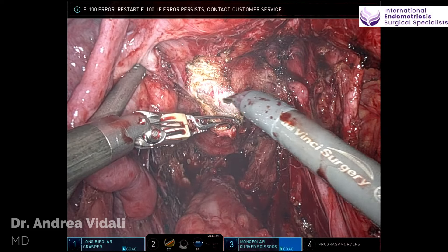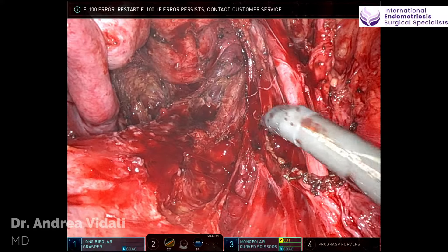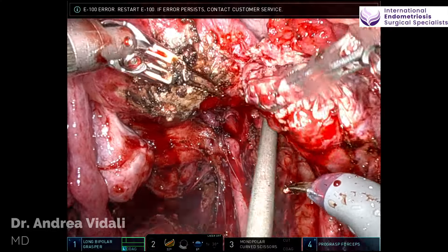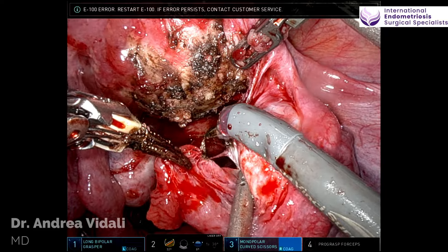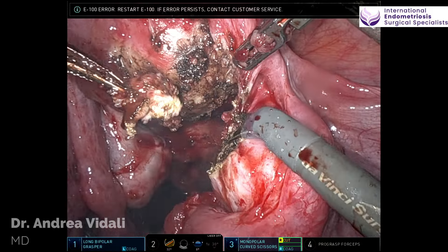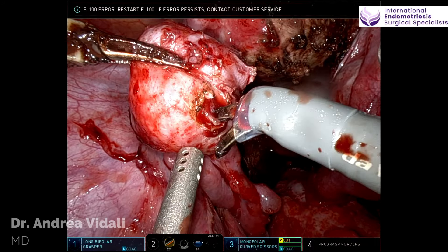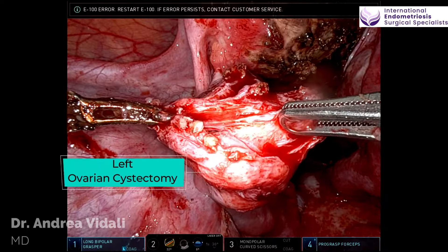Attention is now on the opposite side and the posterior aspect of the uterus. You could see preservation of the nerve bundles on both sides of the rectum. Please notice the role of the assistant — rectal traction is extremely important. I am dissecting off the right fallopian tube. The right fallopian tube is a little bit distended and enlarged, but following the patient's wishes, we preserved the right tube, although it was a little bit dilated. Because the fimbria were open, I felt comfortable given their young age to preserve the fallopian tube.